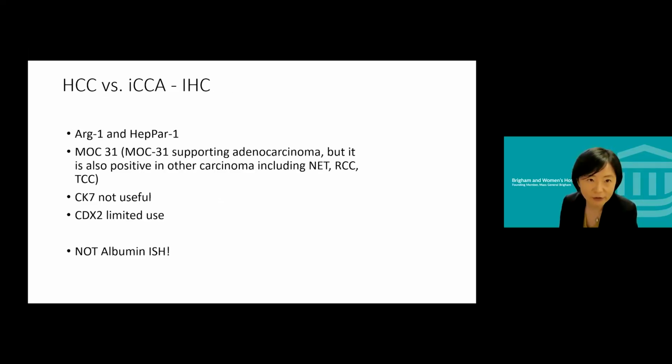So here's a panel I use to make such a distinction. Arginase 1 and HepPar-1 are both very good hepatocellular markers, especially arginase 1. I like MOC31 a lot to support the diagnosis of adenocarcinoma. Although some papers report up to 30% positivity in HCC, in our lab we found it's pretty specific. In 90% of HCC, they show negative MOC31.